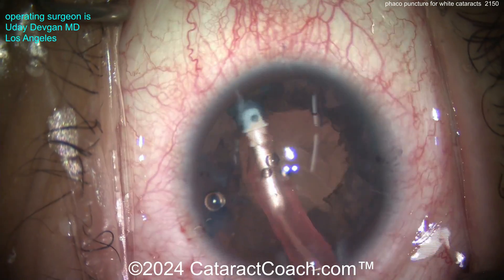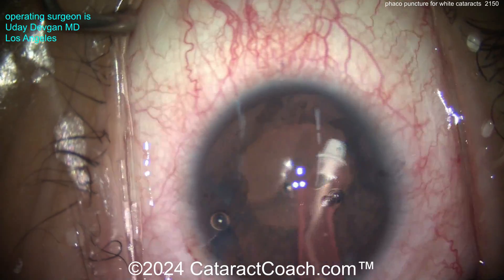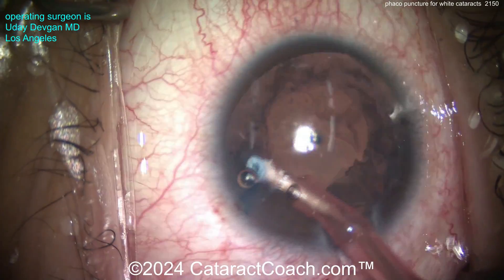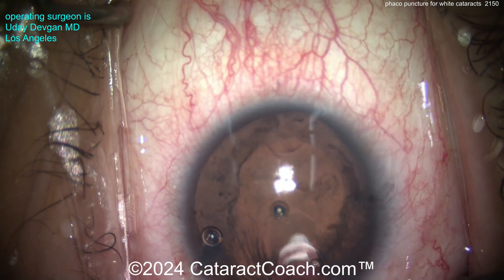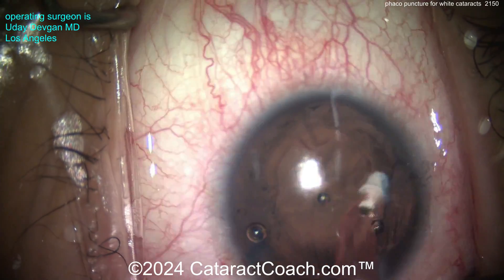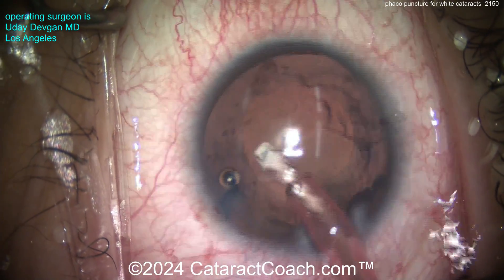Cleaning up now. Lens is out. We've got a lot of lens cortex adhering to the bag, so we'll use the IA probe and take our time to clean up as much as we can. Keep in mind: sometimes white cataracts can stain, fibrose, or scar the capsule bag, and you may not be able to remove all the opacities. But we can certainly try — using vacuum and some mechanical polishing to really clean it up.